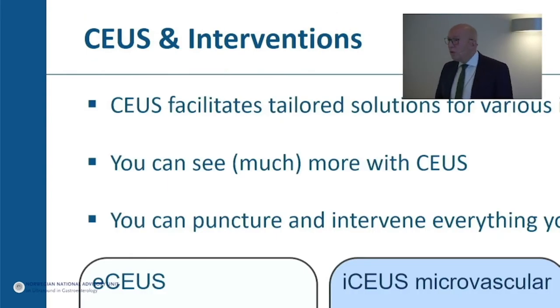This is the splenic artery, which is curved in this case, and this was successful in technical and in clinical terms. I come to my conclusion. First, I wanted to show you that contrast-enhanced ultrasound facilitates tailored solutions for various interventional problems, and that is the reason that we have not so big studies. We have case studies, we have collections of 7 or 5 cases sometimes, and only for biopsy we have some valid prospective studies.